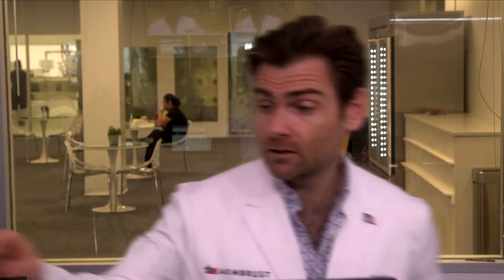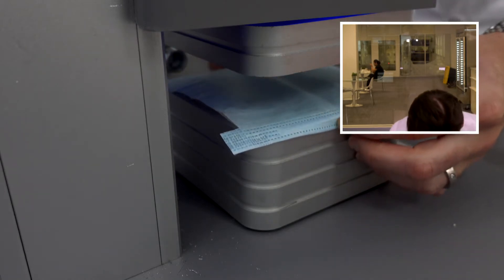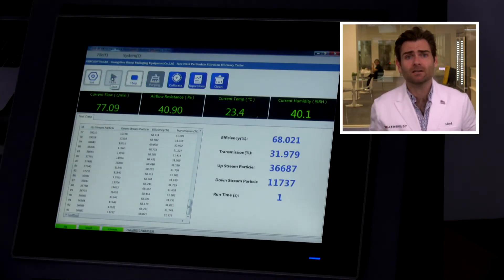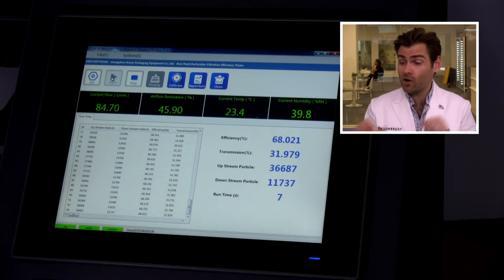Welcome back — today we are testing Indian masks. We're looking at the very popular Romsons masks. Let's put it in the clamp. This is a PFE machine — particulate filtration efficiency machine. If you want to find out more about how this works, check out the link. Keep in mind we are just testing the fabric of the mask here, and both fit and filtration are important when considering a mask.